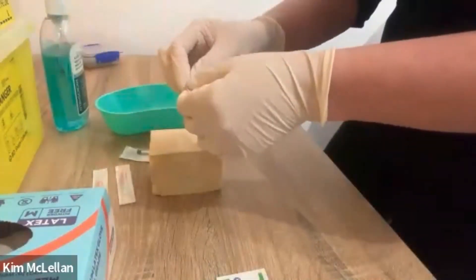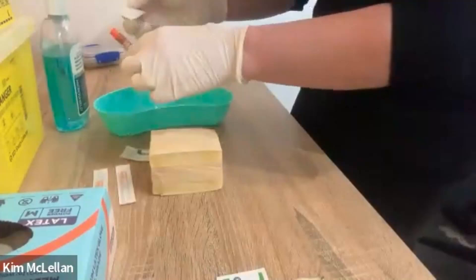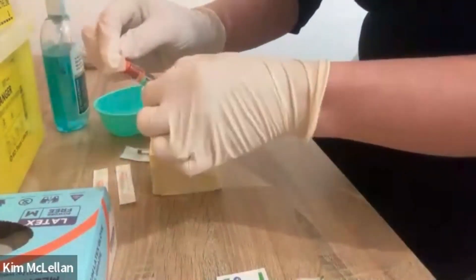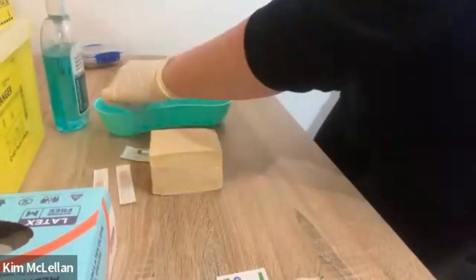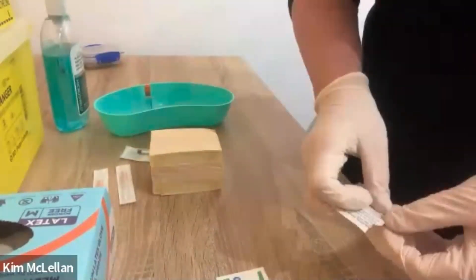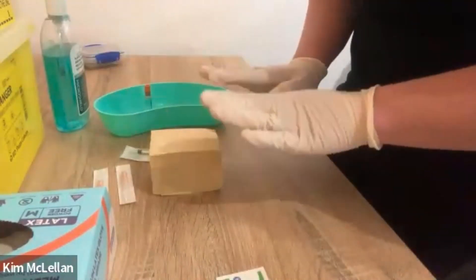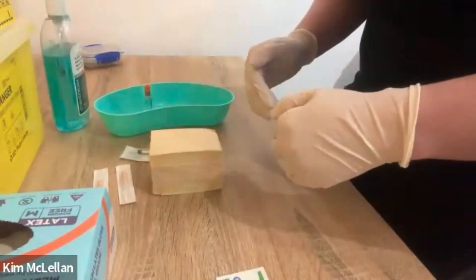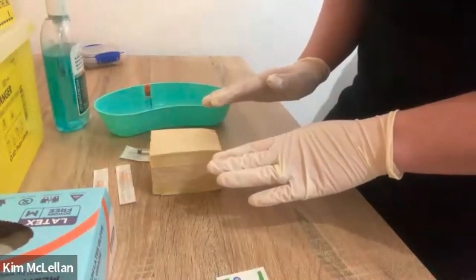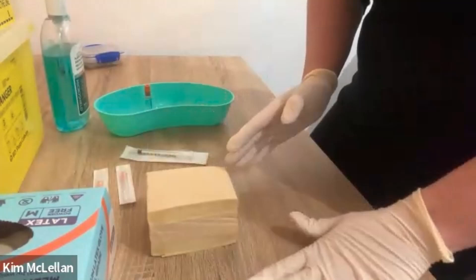Now, the alcohol swab is not to swab the abdomen. It literally is to swab the top of your vial — the bung there. We need to make sure that is nice and clean, so we let that dry. We don't actually wash the area before we administer the injection with an alcohol swab, unless the abdomen or the patient's body is visibly soiled.